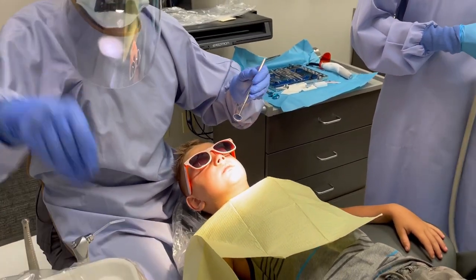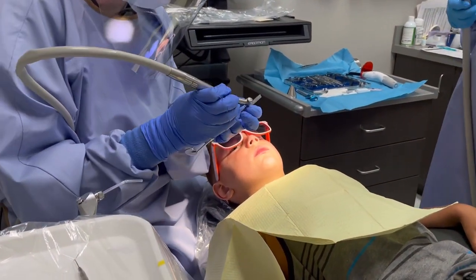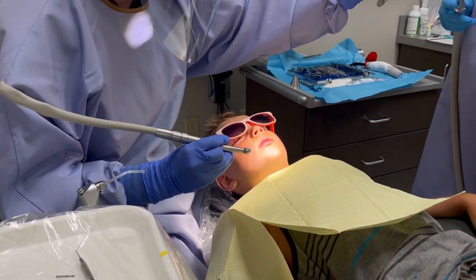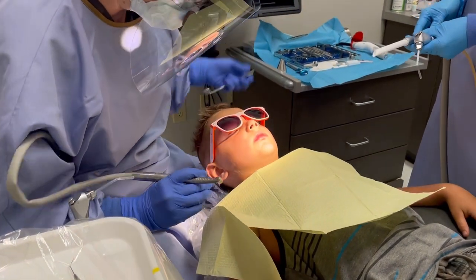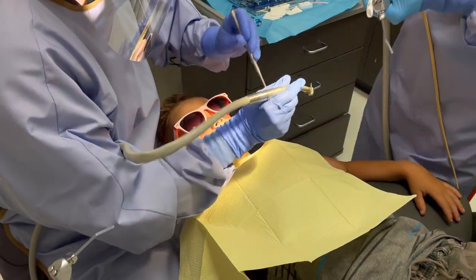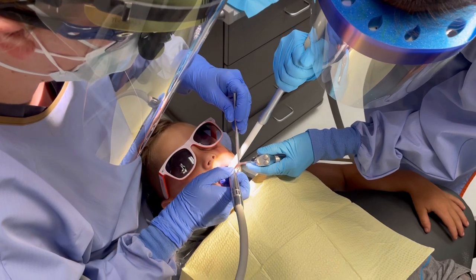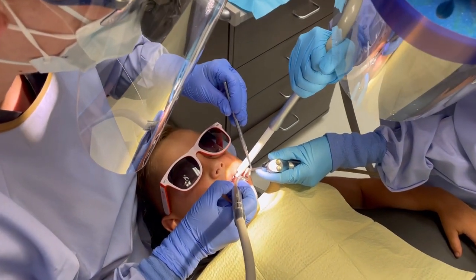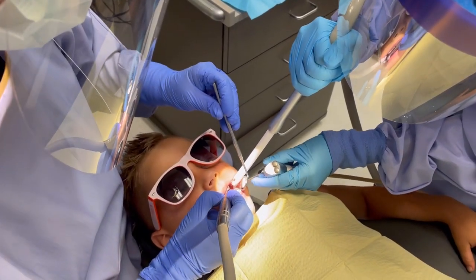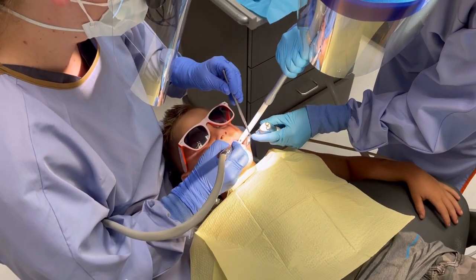You're going to feel a little bit of vibration — bump, bump, bump. It does squirt some air and water, so there's going to be a little vacuum here. It's going to make a noise to slurp up all the extra water, okay? Go ahead and open wide. And then just stay nice and open just like that. Beautiful. Good job.